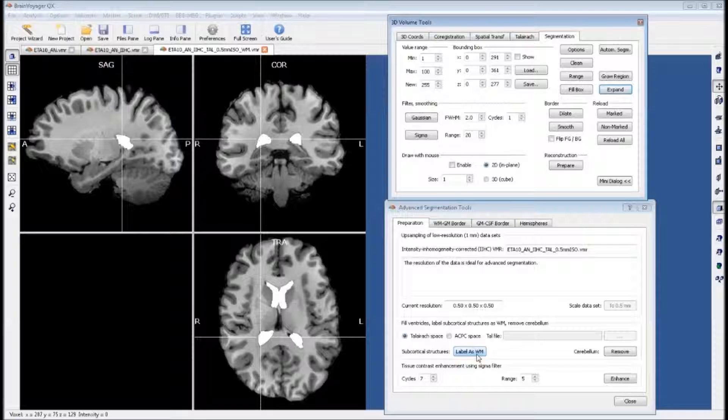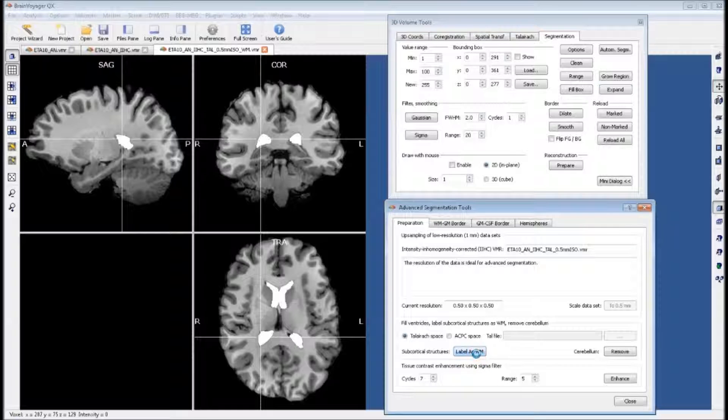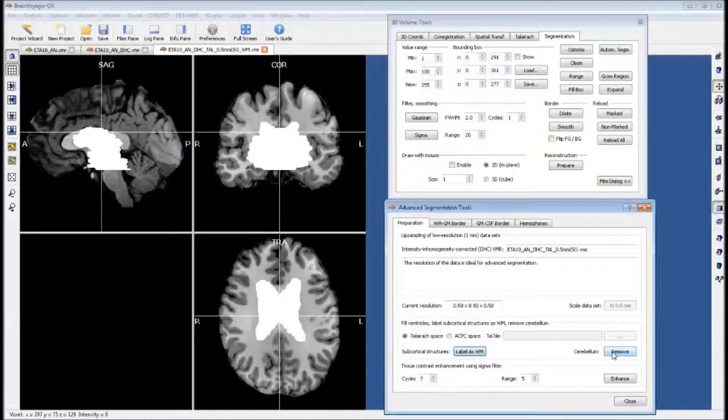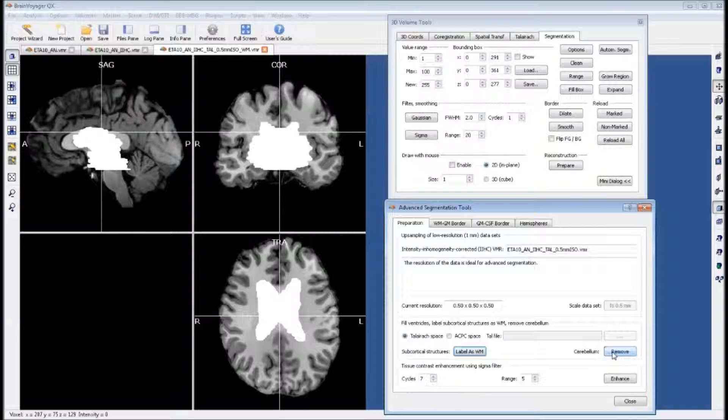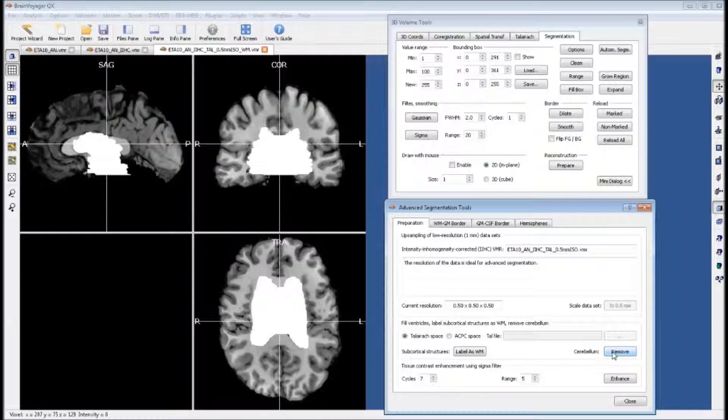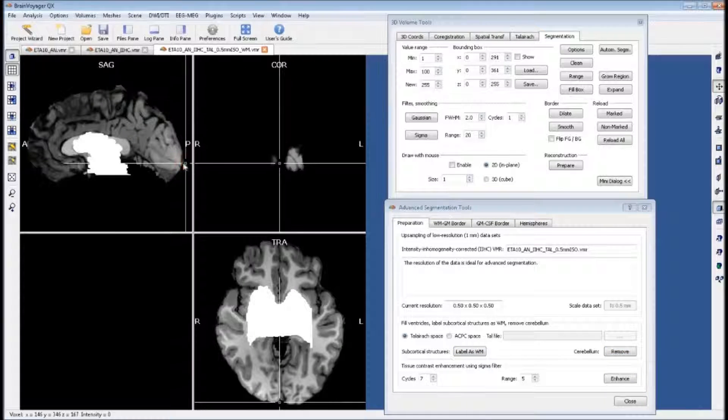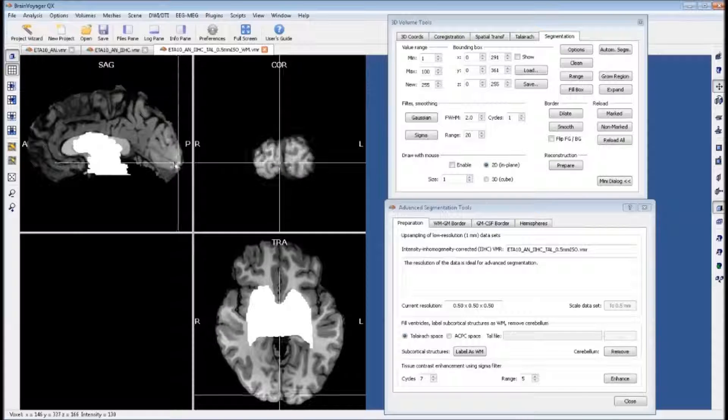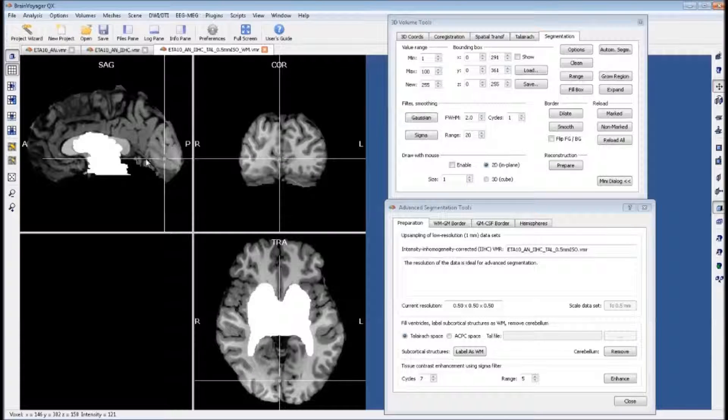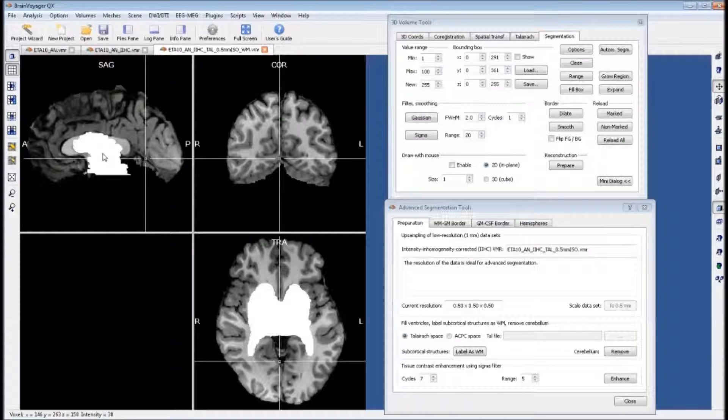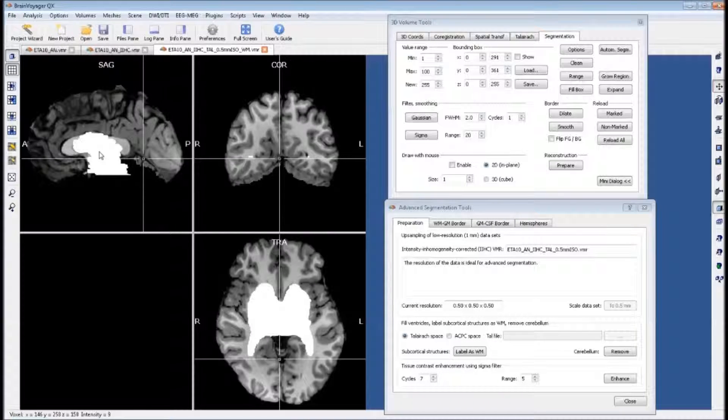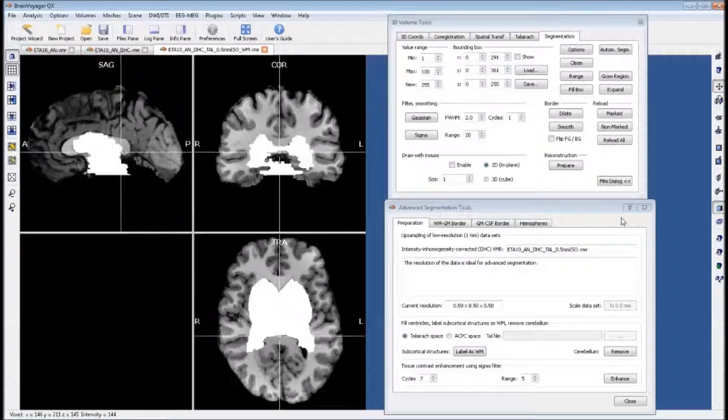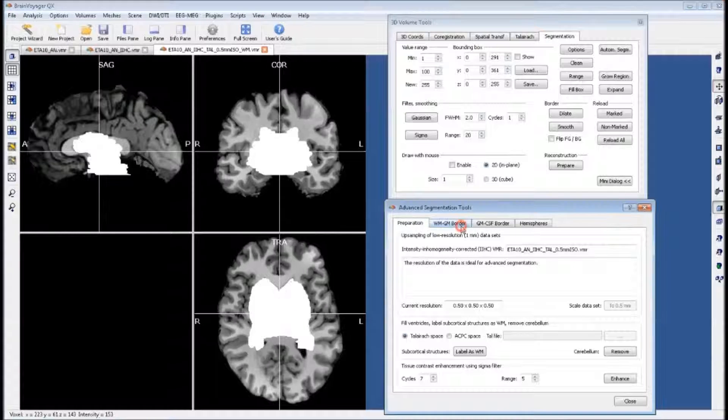In our advanced segmentation tools window we want to label this as white matter. The result will look something like this. We can then remove the cerebellum. What we want to do here is just check that the cerebellum removal tool hasn't removed any of the cortex. This looks fine.